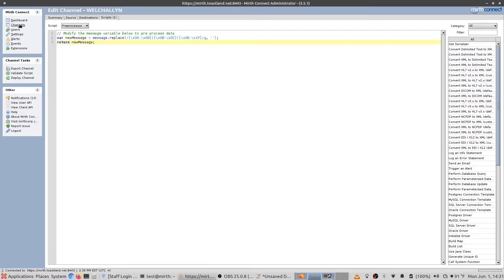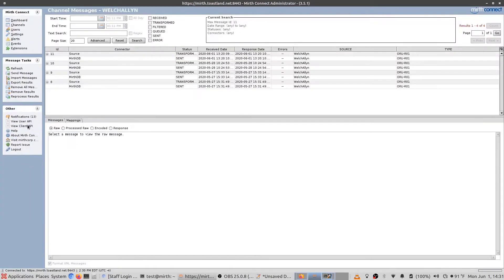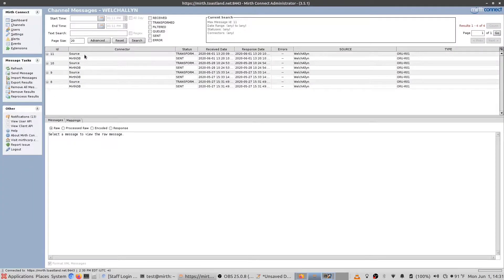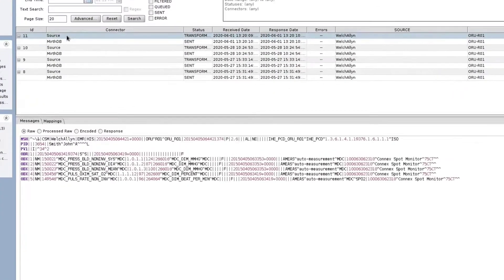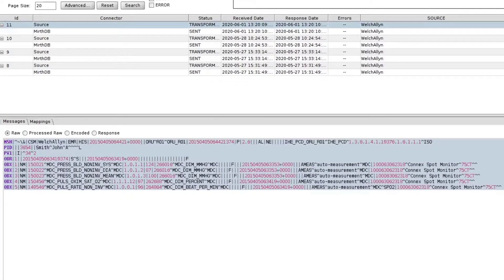And again, this is similar to MirthConnect in the sense that we can go to channels and then view messages. Down here we can look at the uninterpreted message, which looks exactly the same as what Wireshark is reporting.